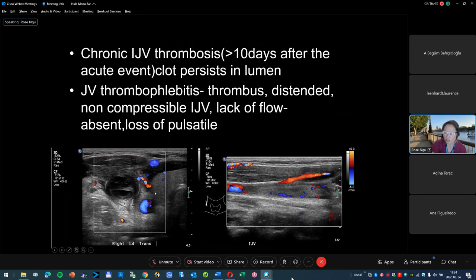So remember your carotid artery sitting there next to your thyroid gland. Lateral to the common carotid is your IJV, and your IJV should be nice and hypoechoic with good flow within it. However, if you find that there's something in your IJV, turn your probe around, and if it's solid looking like this, this is a thrombosis within the IJV.